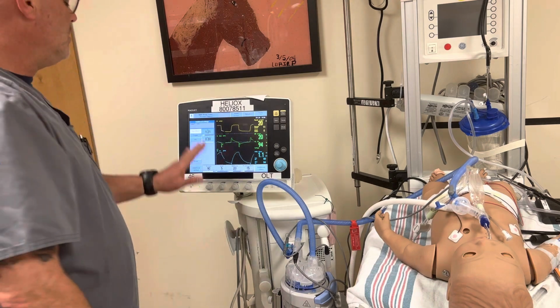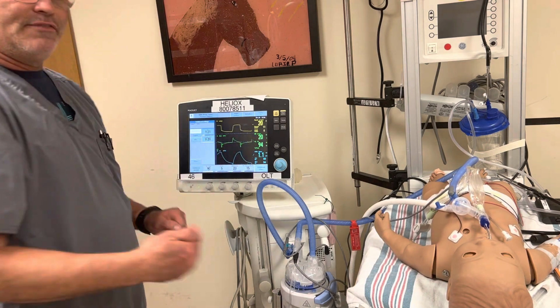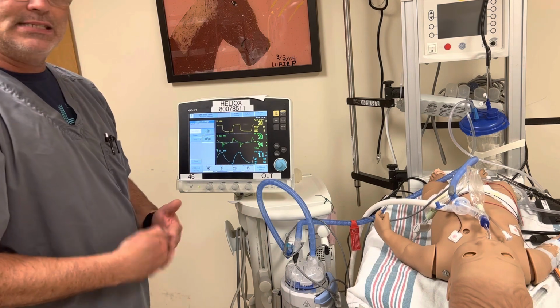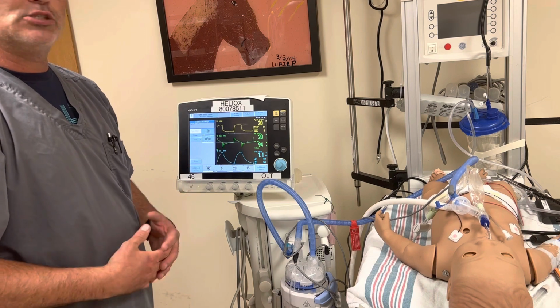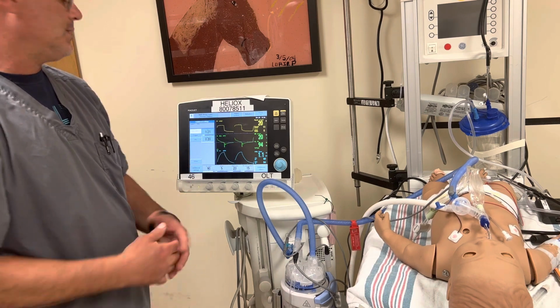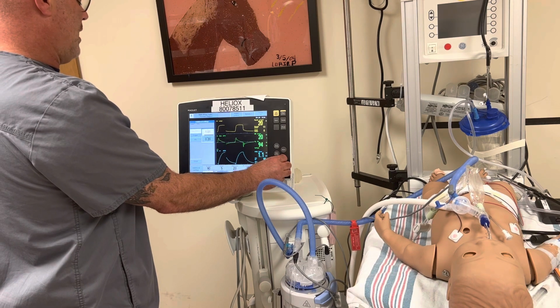But without that, we are going to set zero flow. Now, we have to get to zero flow. Again, we have to get to zero flow. If we can't get to zero flow, we have to have a doctor tell us what to set that time frame and order it. Okay, so we get to zero flow on this mannequin at 1 second, so we're good there.